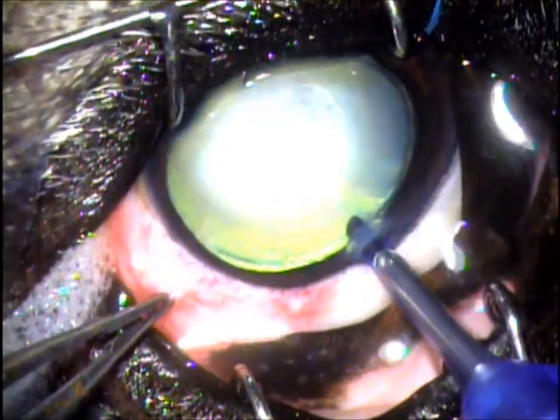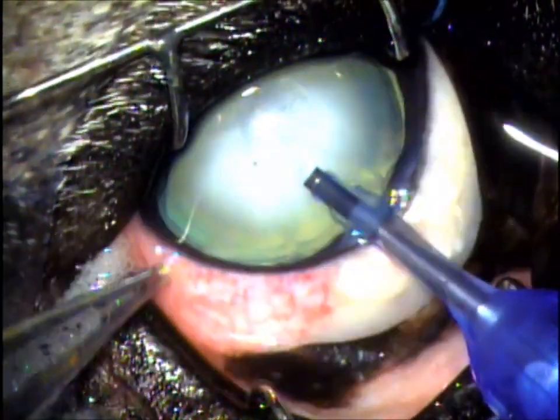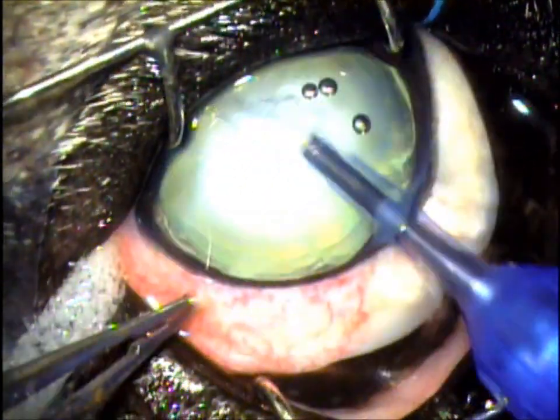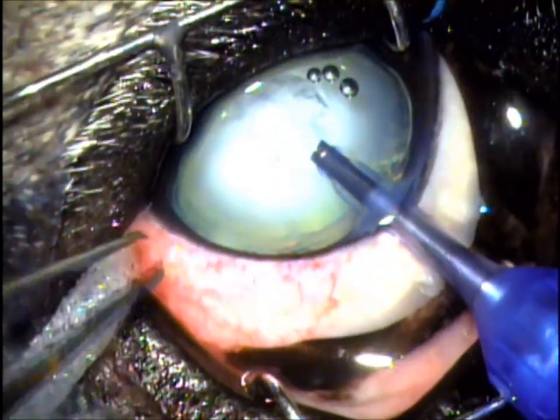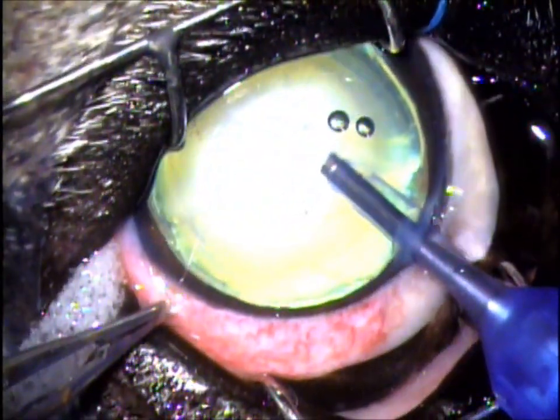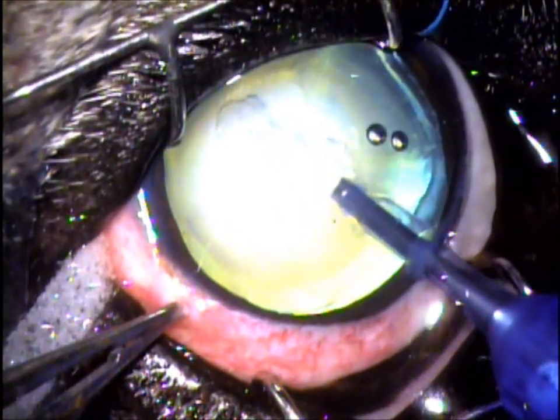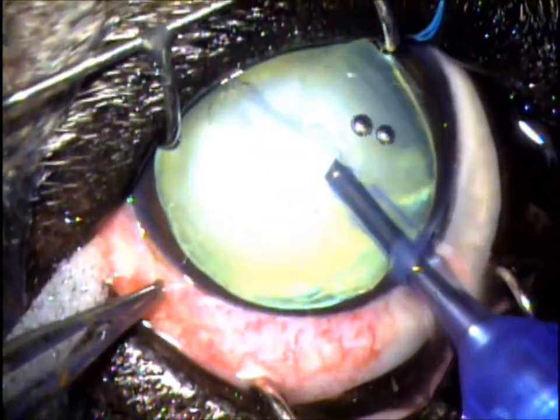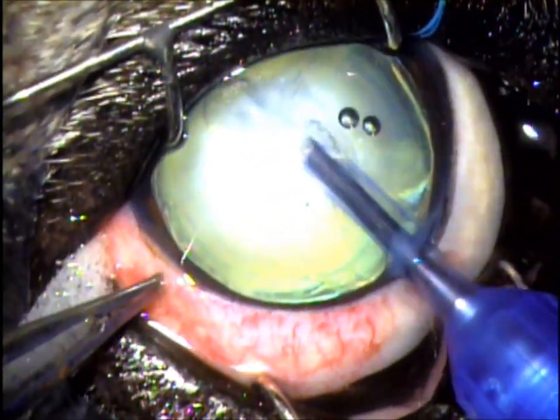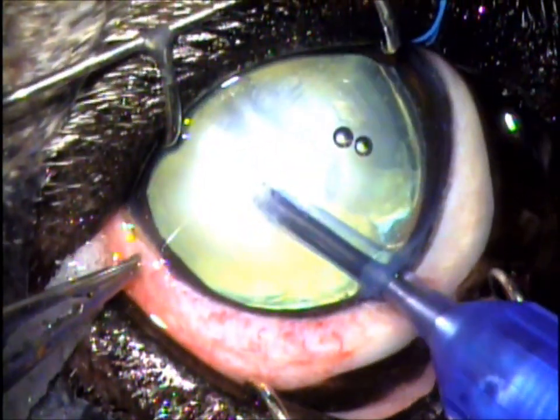With that out, we then introduce the phacoemulsifier tip. This is actually a high-frequency ultrasound probe, and it basically is like a little jackhammer — it breaks up the lens using ultrasound vibrations. As the lens breaks up, it'll be extracted through the cannula, through the needle itself. There's also fluid being pushed into the eye by this specially made instrument. And you can see here sculpting the lens, removing the central portion of it, taking out this cataract.